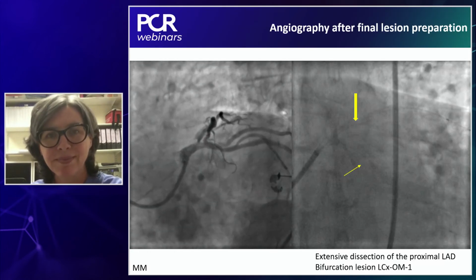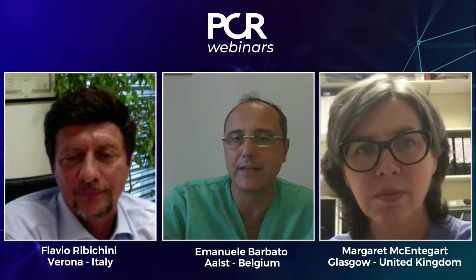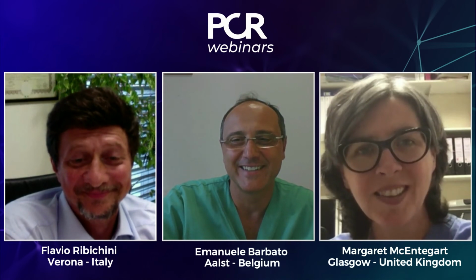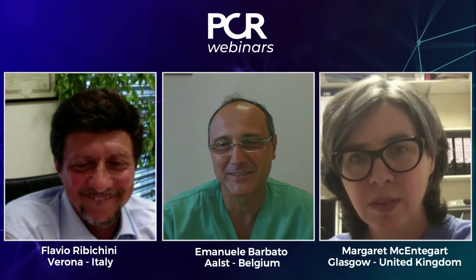Okay. Can I quickly drop a question from Christian Dunn in this regard? If after rotational atherectomy and further dilatation with non-compliant balloon, the lesion is not dilatable and you even end up with a dissection, what are you doing? What would you do next? Yes. So you did rota, you did non-compliant balloon, you have a beautiful dissection, but you still have a waist in your balloon. What do we do next?